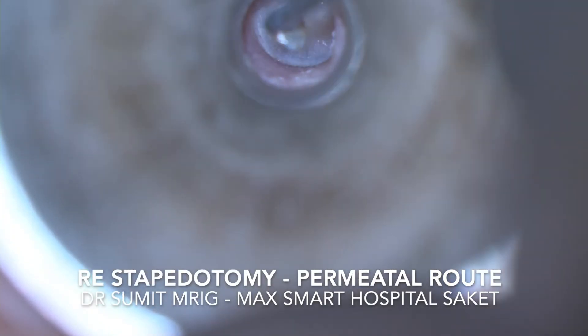Good afternoon. Today we are going to demonstrate right ear stapedotomy through the transmeatal route. After infiltration of 1 in 10,000 lignocaine and adrenaline, we wait for 10 minutes and then give the Rosen incision with a circular knife which is 5 to 6 millimeters lateral to the annulus.